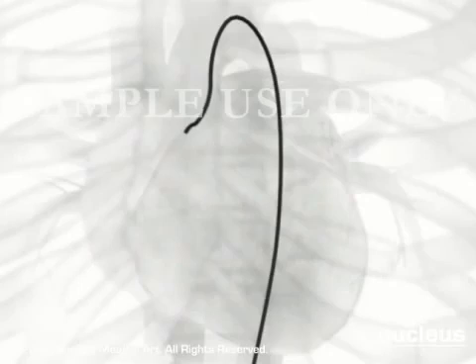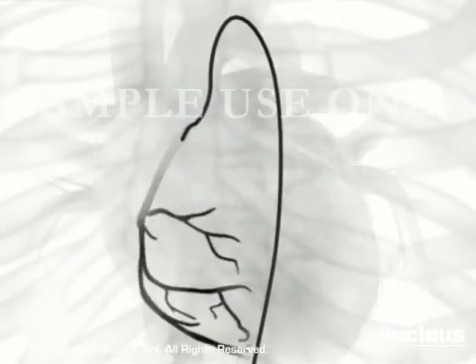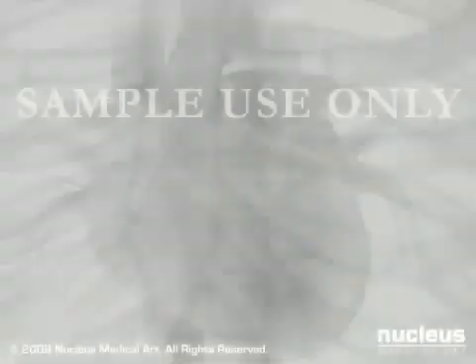After sufficient images of both coronary arteries and their tributaries have been recorded, the catheter will be removed through the groin. Pressure must be applied over the femoral artery to prevent bleeding.